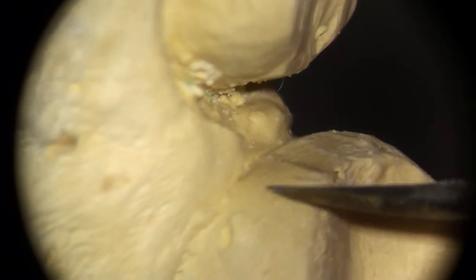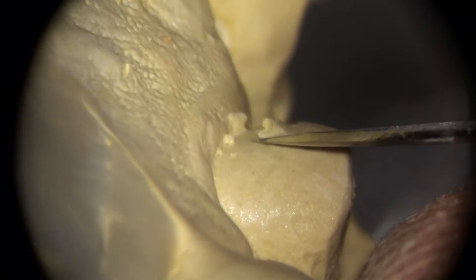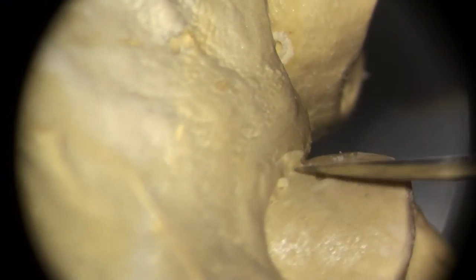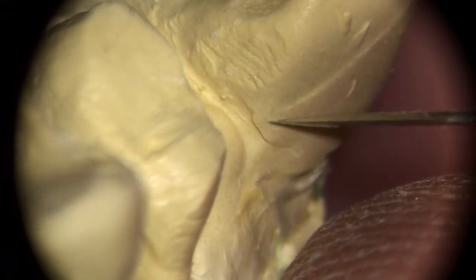A lot of times you'll see it on the adjacent teeth as well. Gotta watch out for these little drags on the adjacent, because we're fitting our tooth in next to that, and that'll mess with our shape a little bit. Get confusing later on if you're not noticing that. And the impression didn't go all the way up here, so there were lots of places where we got bubbles. Good part is we don't have to worry about those, because we're just working with the prep that we're actually working on.